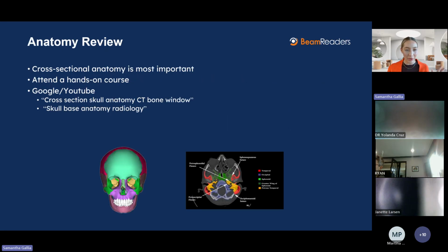All right, anatomy review. So now we're going to go into, like I said, we are not going to be able to review every single piece of anatomy. That would take way too long. And there are courses for that. So I really encourage, if you are into CBCT, you've bought into it, you've decided, yes, I'm going to utilize this skill set to improve my patient care, I encourage every single one of you to take an in-depth anatomy review course, because there is so much anatomy in the maxillofacial complex that we're not used to looking at when we take our 2D images.